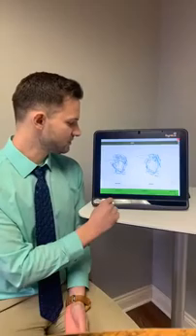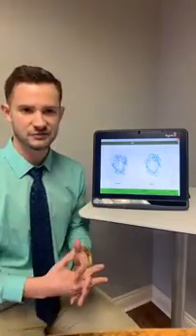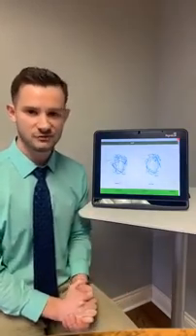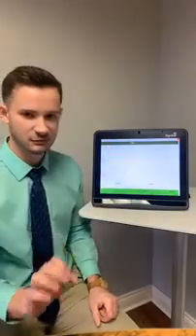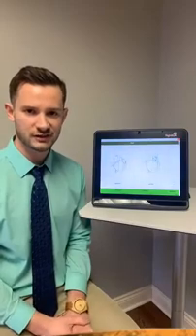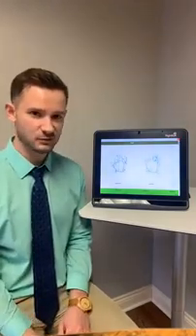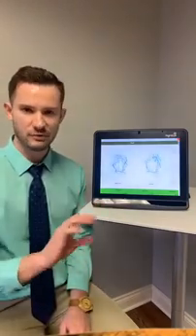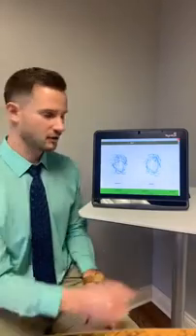We see several different problems here. First it's just inaccuracy, difficulty maintaining accurate fixation on the moving target. There's also a lot of jerky movement so it doesn't look very smooth. If you watch it again there's lots of quick jumps instead of smoothly and slowly tracking that target. And we also see fixation losses where they could be tracking for a few seconds and then their eyes jump away from the target. They lose, their eyes are not able to stay on target.